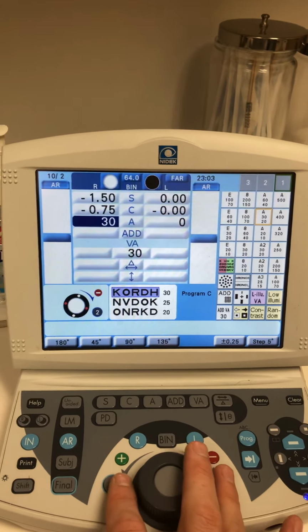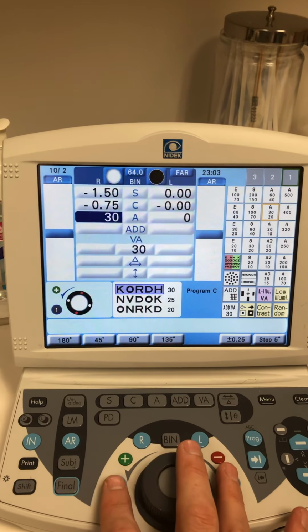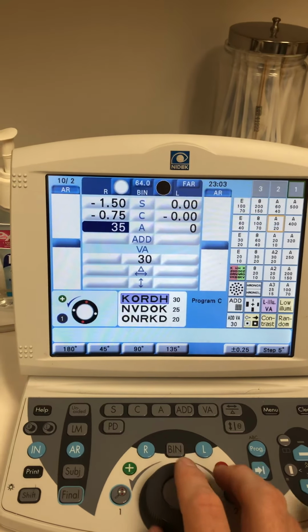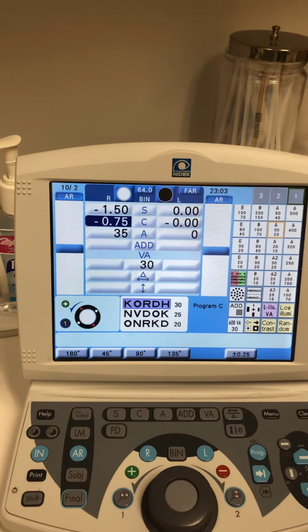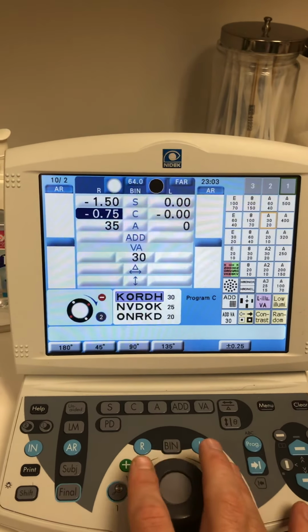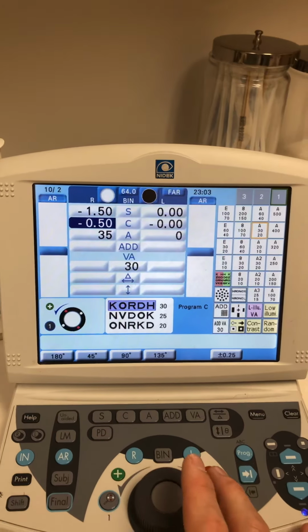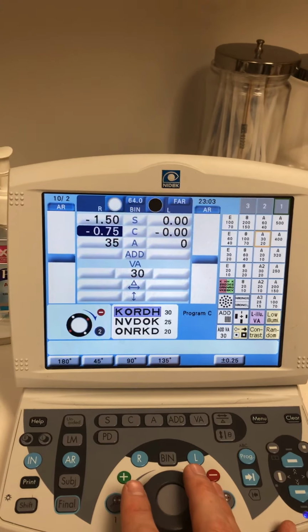Then just repeat until the patient says same, just like your standard refraction. 1, 2, picks 1, rotate to the left because the arrow tells you to go to the left. 1, 2, they're the same. So then you're gonna refine your cyl. And it's the exact same process, just rinse and repeat. 1, 2, boom. If it's 2, you're gonna turn to your left because the arrow told you to. Same thing, 3, 4, 3, boom, same thing.